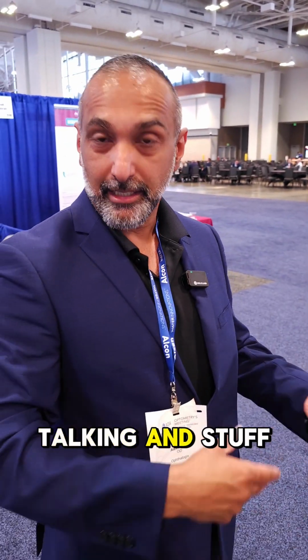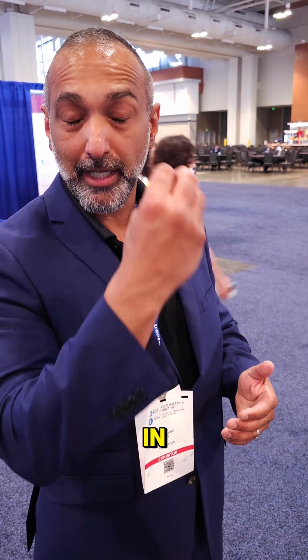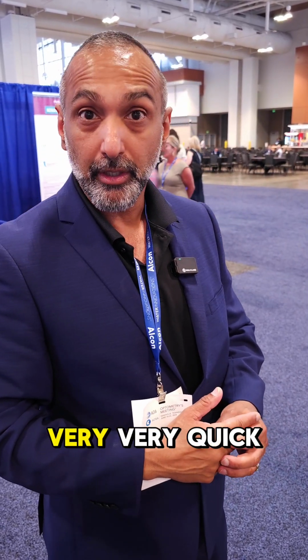So if we took all the talking and the explaining out of it, it's very, very quick. From the time she gets the proparacaine drop, from the time she opens her eye to the time she closes her eye and the procedure is done, maybe 30 seconds tops, maybe 20 seconds, something like that. Very, very quick. But when we add all this to it, it adds a minute or two to it.